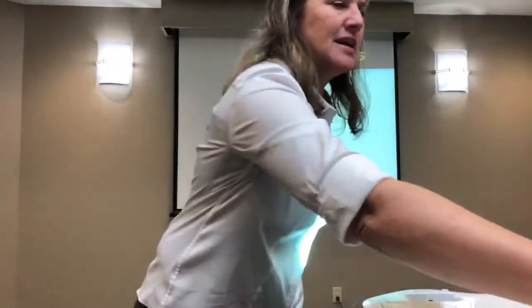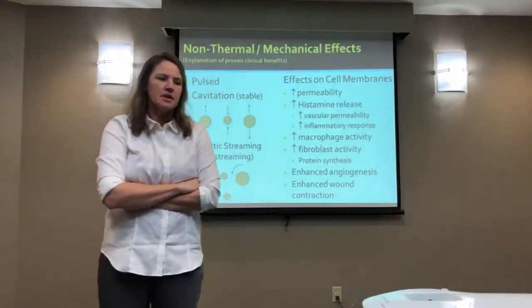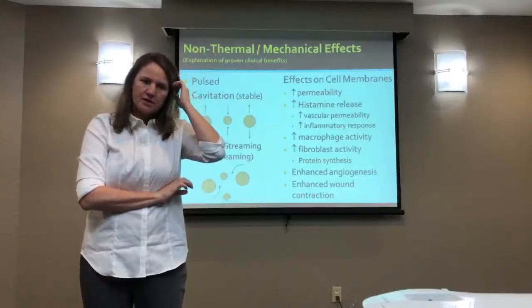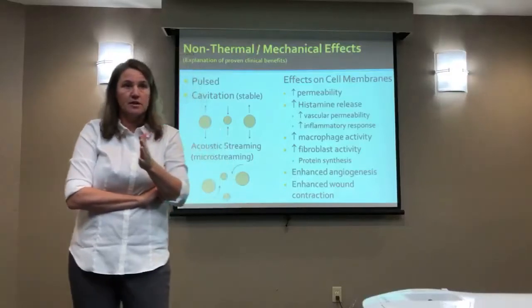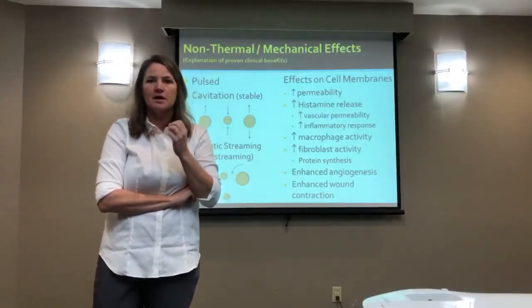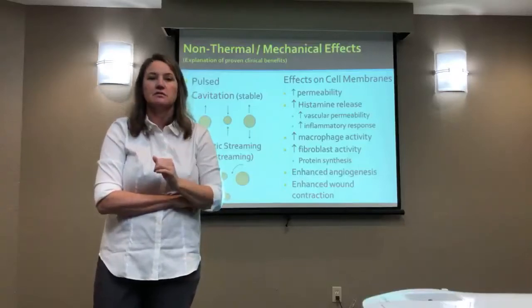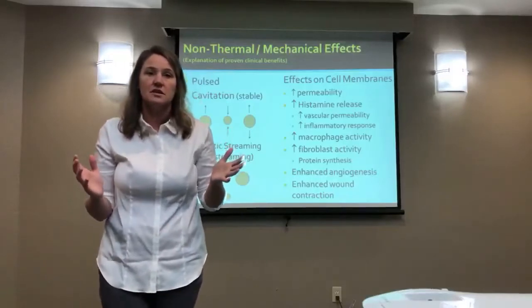Okay, so that's heat. Now let's switch gears and talk about the non-thermal mechanical effects. So back when early researchers were using ultrasound, it was most credited with its heat. And even myself, I graduated in '91, I remember in my mind thinking that the majority of treatments you do with ultrasound, any benefit you're going to get is due to heat. That was just the way our thought process was, and that's what most of the research studies credited.